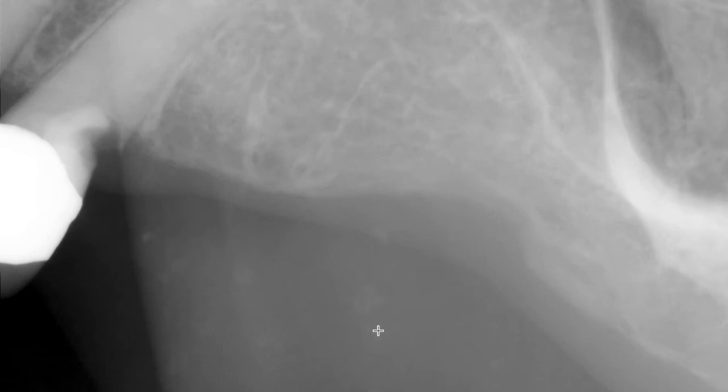So here we have some more on the other side. Not nearly as much as we had on the patient's right side, but you can tell there's still quite a few.